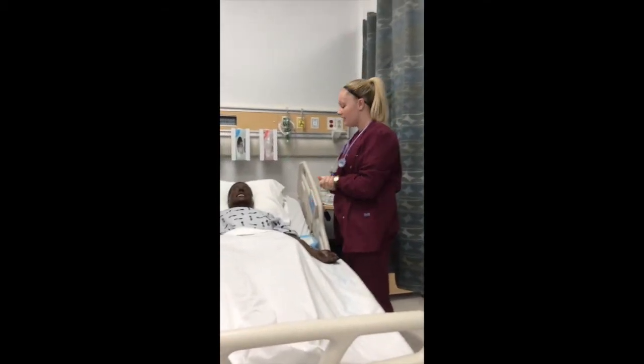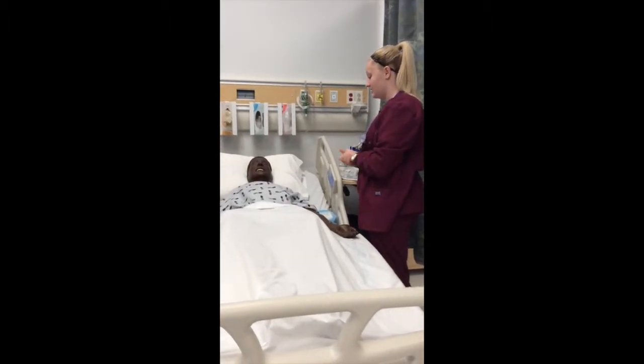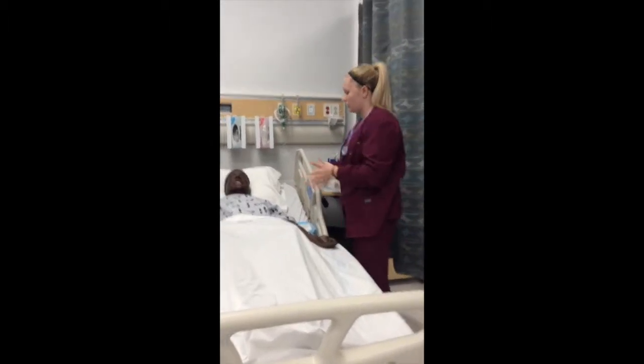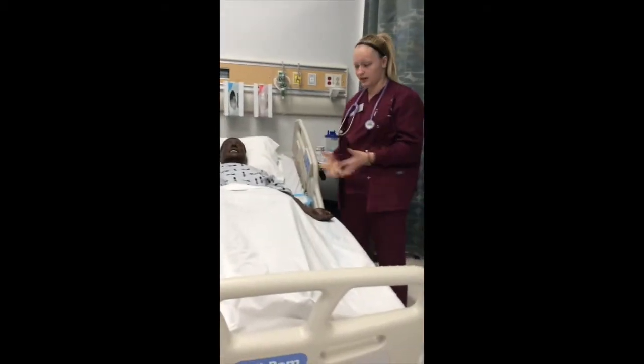Okay. Well, I'm here today because the doctor has ordered for me to give you an NG tube. So what that is, it's a nasogastric tube. It goes through your nose and into your stomach. And the purpose of this is, you know, you've been experiencing a lot of nausea and vomiting, or you just need some decompression for other reasons.